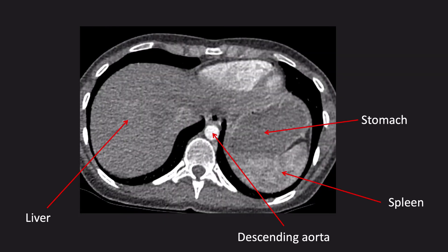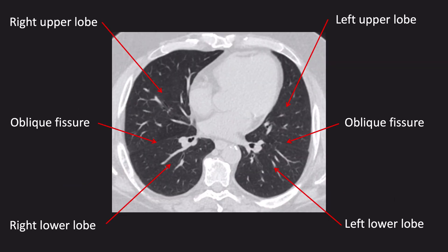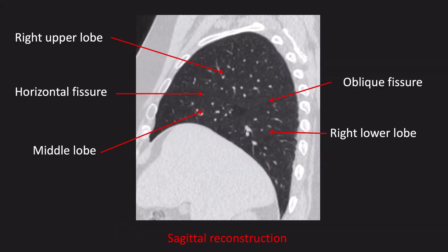Below the diaphragm, we can see the liver on the right and the spleen on the left with the stomach. As mentioned, the lungs are divided by fissures. The oblique fissure divides the upper and lower lobes from each other. On the right, the horizontal fissure divides the upper lobe from the middle lobe. If we look at a sagittal reconstruction, you can see the upper and middle lobes lie anteriorly in the chest and the lower lobes posteriorly.